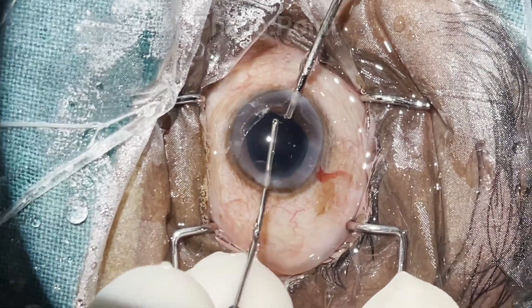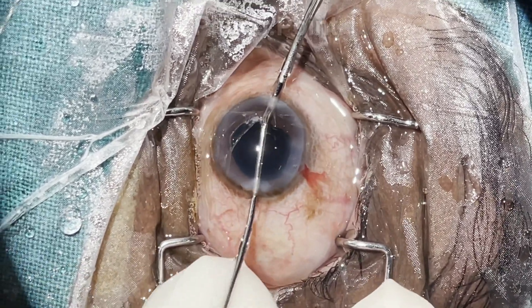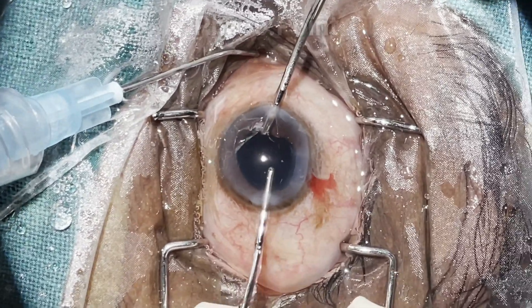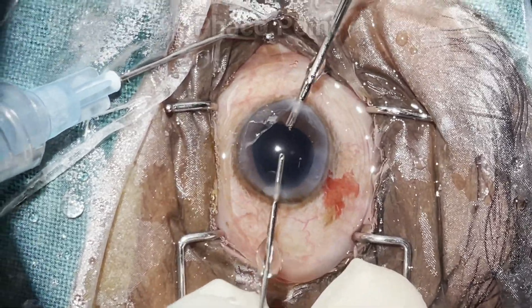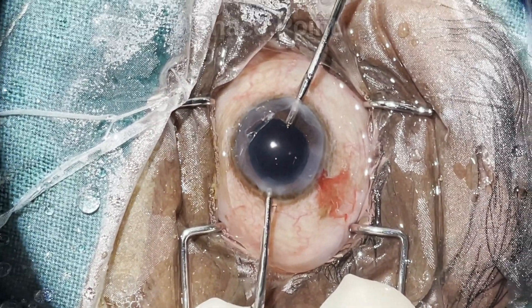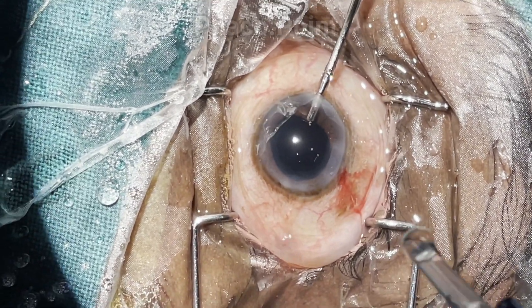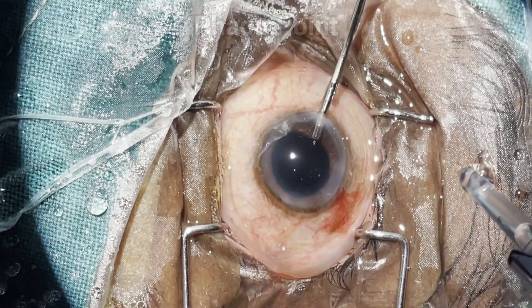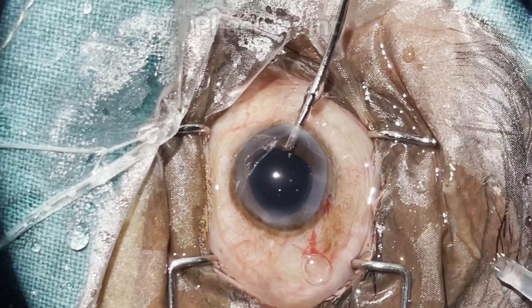Upon completion of irrigation aspiration, look carefully if any amount of the dispersive viscoelastic is still stuck to the endothelium. If so, it can be removed as demonstrated. While maintaining focus on the capsular bag, the aspiration cannula is removed. The irrigation continues to remain not only as a source of irrigation to maintain the spaces before insertion of the IOL, but also to afford some counter pressure before IOL insertion.